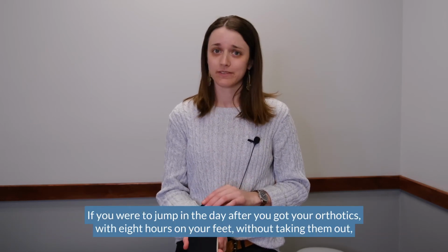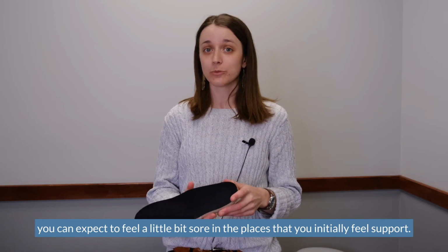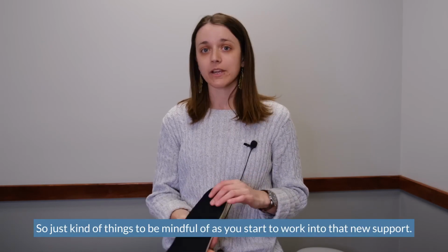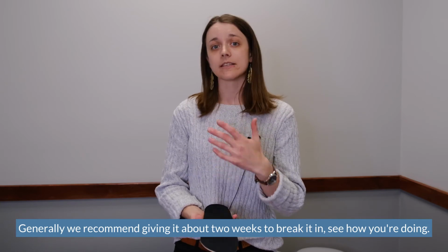If you were to jump in the day after you got your orthotics with 8 hours on your feet without taking them out, you can expect to feel a little bit sore in the places that you initially feel support. So just things to be mindful of as you start to work into that new support. Generally, we recommend giving it about 2 weeks to break it in, see how you're doing.